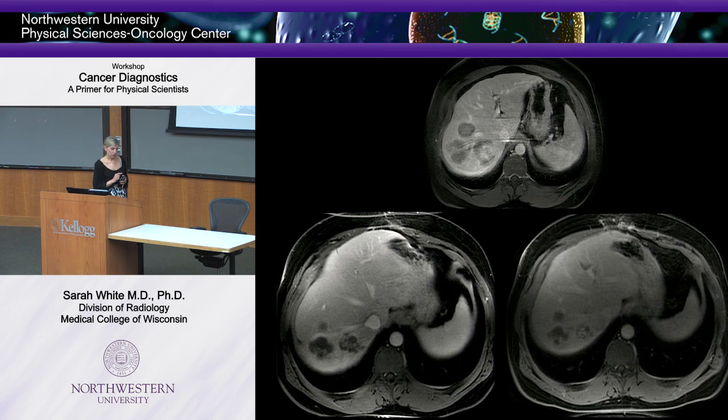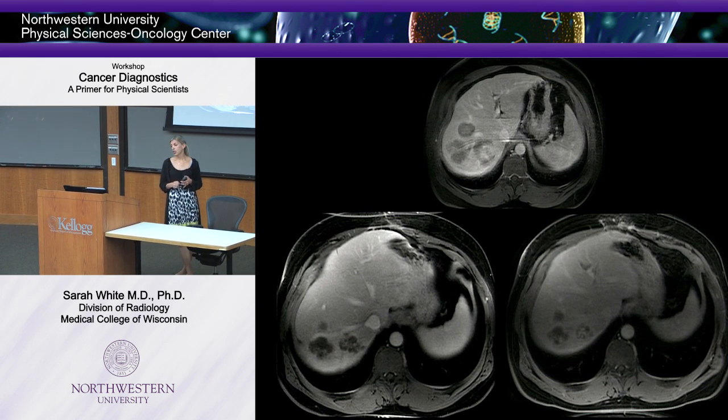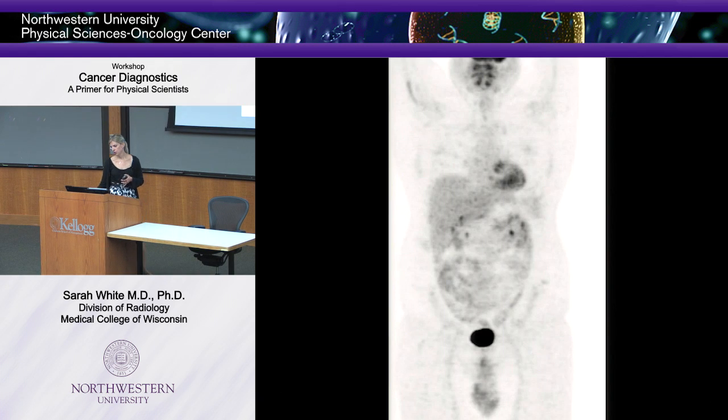And so we actually referred him to our transplant center. We knew he didn't have extrahepatic disease, but on subsequent imaging, we saw a little dot, okay, we saw something right where they had resected him. It was a little dot. We said, we don't know if this is cancer or not. The transplant surgeon said, we'll transplant him if you can prove to me he doesn't have extrahepatic disease. So do we try to stick a needle into a little dot? Do I try to get my ultrasound probe and go swimming around in a millimeter? No. So we didn't. So we went back to imaging again. Let's do a PET scan.